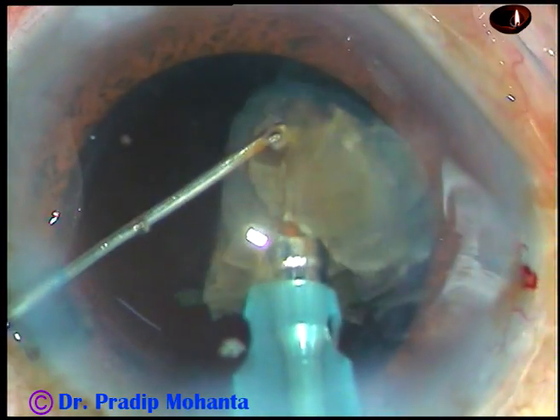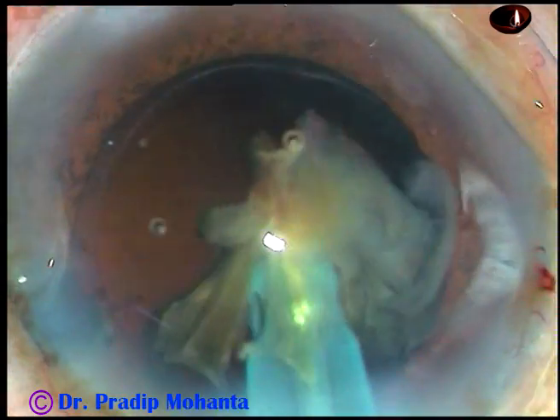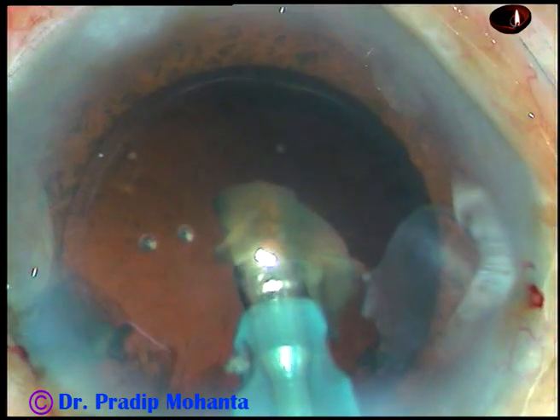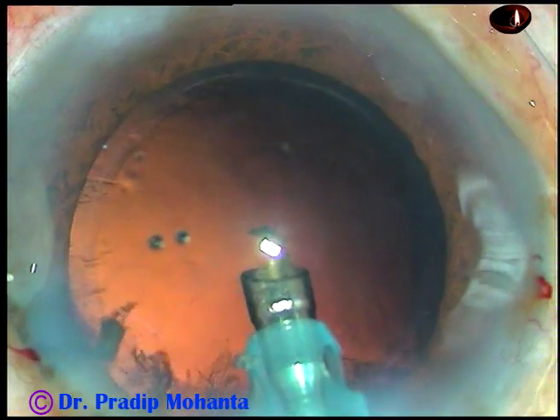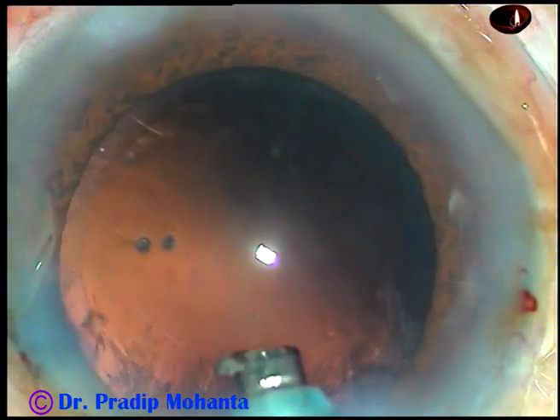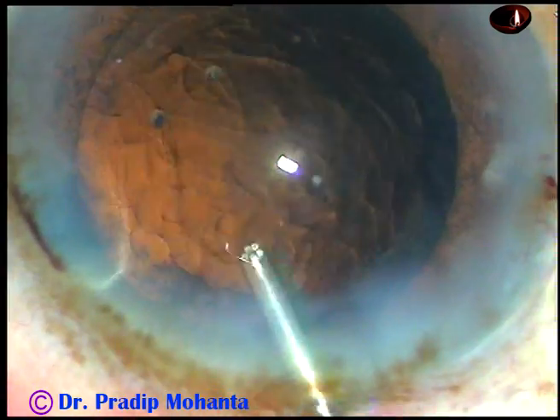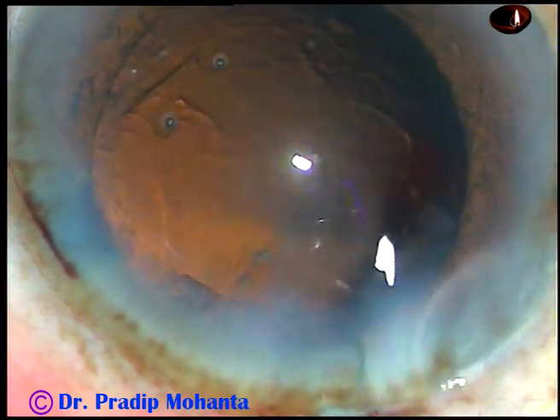And this is the last portion of the nucleus. I have removed the chopper so that leakage from the side port stops — and yes, it stops and the anterior chamber becomes more stable. One piece has come, and then another piece. The nucleus and epinucleus have been removed. In this case, the epinucleus was incorporated into the nucleus.